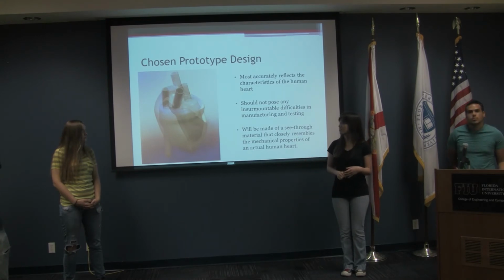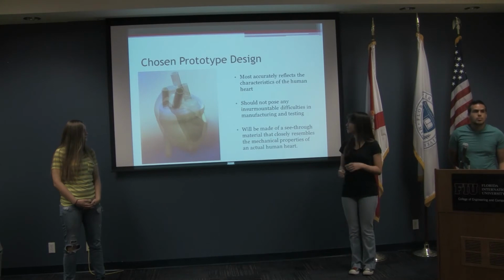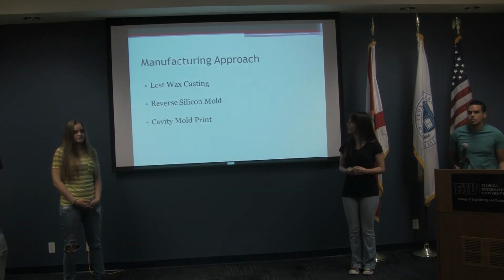It most accurately represents the characteristics of a heart, and it's going to be more difficult, but it's not going to be impossible to produce. We also hope that our polymer can be see-through so that we can watch the flow. We have 3 options for manufacturing it: lost wax casting, reverse silicone molding, and cavity mold printing. All of these involve 3D printing and filling some kind of mold with our chosen polymer.